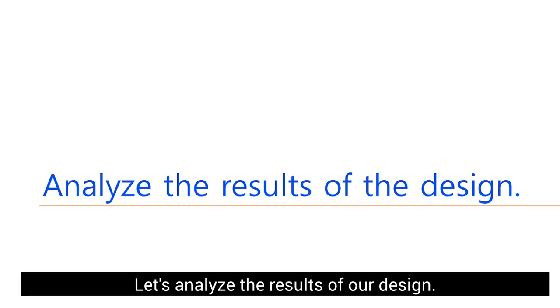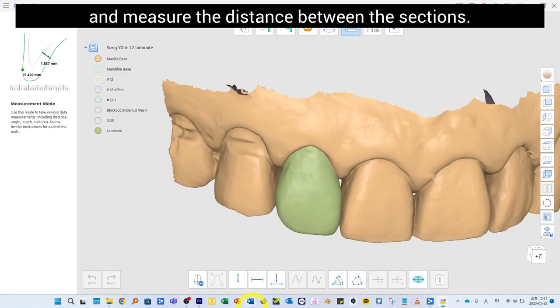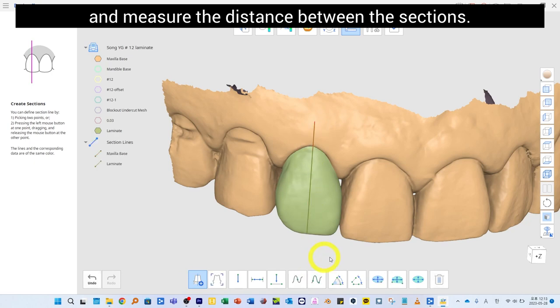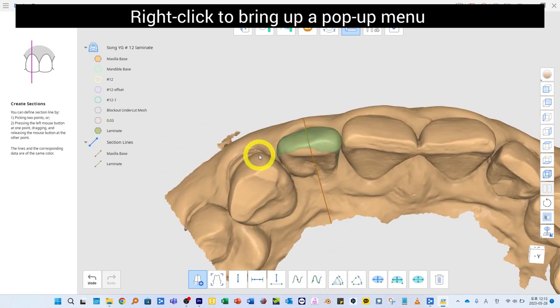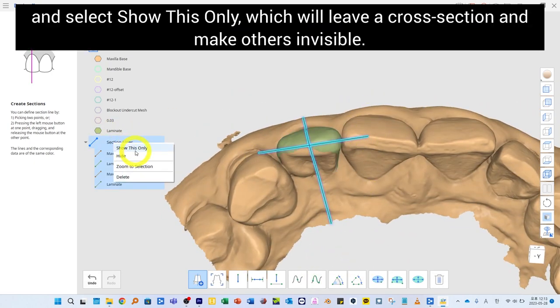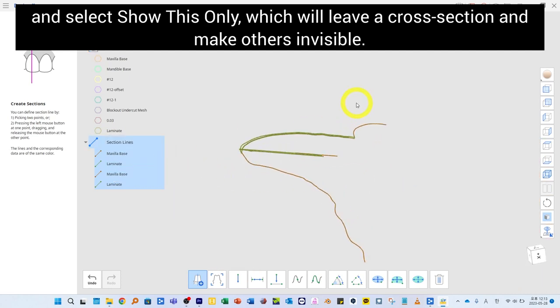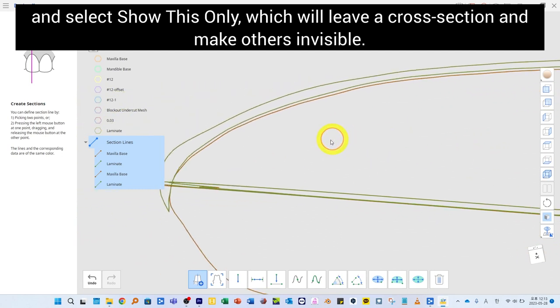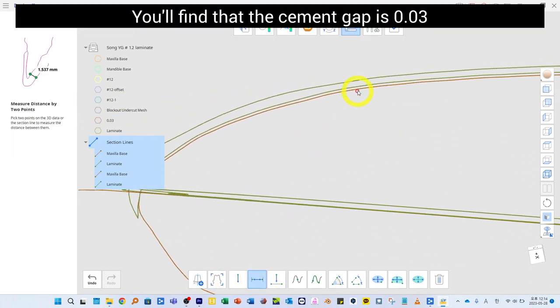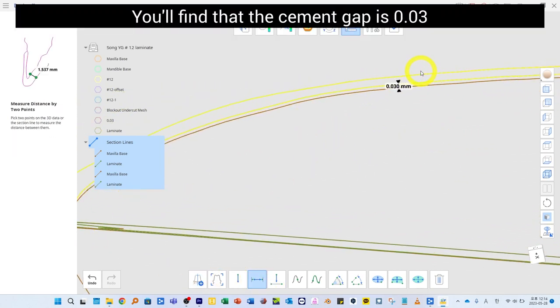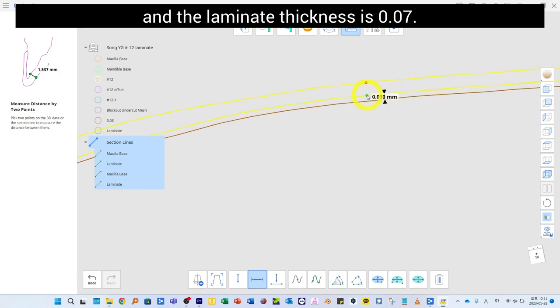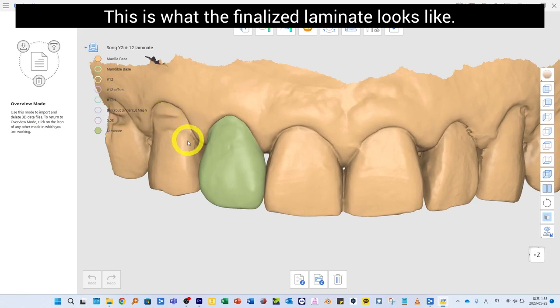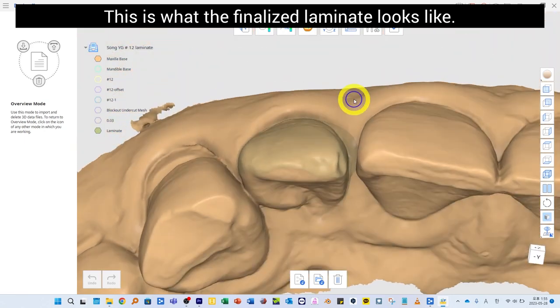Let's analyze the result of our design. Take a cross section and measure the distance between the sections. Right-click to bring up a pop-up menu and select Show This Only, which will display the cross section and make others invisible. You will find that the cement gap is 0.03 millimeter and the laminate thickness is 0.07 millimeter. This is what the finalized laminate looks like.